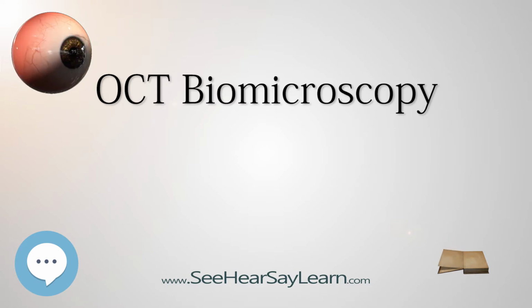Exam data can be lost if the examiner fails to document a finding or does not have the knowledge required to recognize a finding, a limitation that can be amplified by the variability in ophthalmic training around the world. This requirement that the operator be knowledgeable also means that slit-lamp exams must be conducted by trained and experienced personnel, a feature that increases the cost and decreases the number of examiners qualified to perform them.